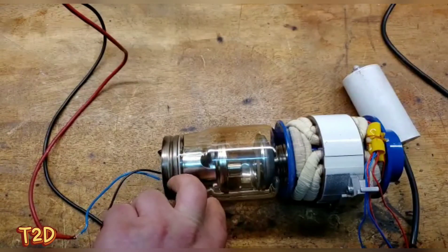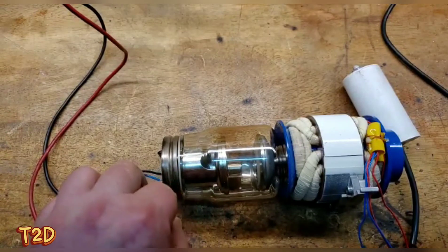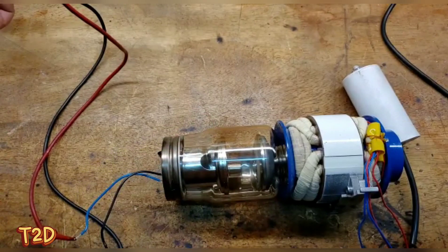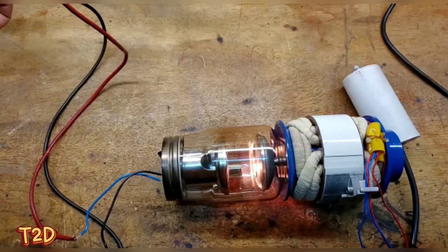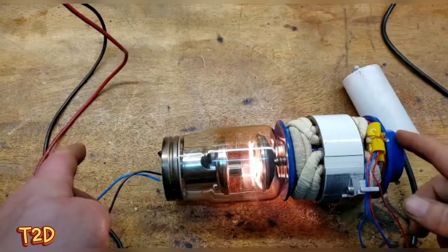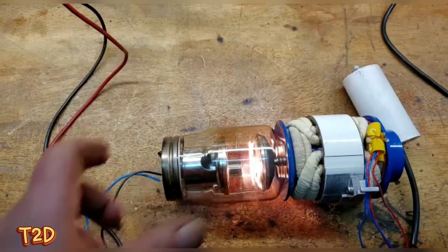The anode is now rotating. A lot of tubes have two heaters - a small focal spot and a large focal spot - but this tube just has one. We'll apply some heater current, and as you can see it starts to glow, creating the thermionic emission. Now all we'd need to do to generate x-rays is apply a large potential difference between the anode and cathode.